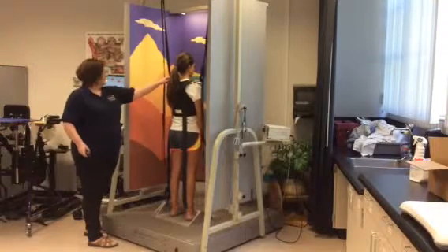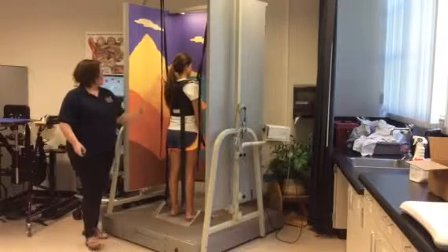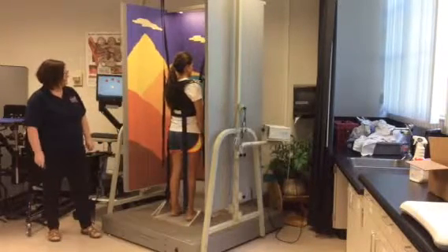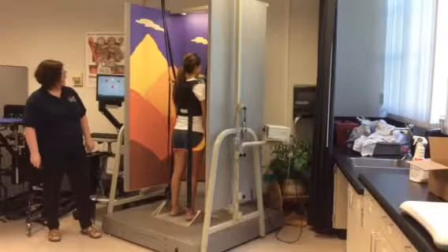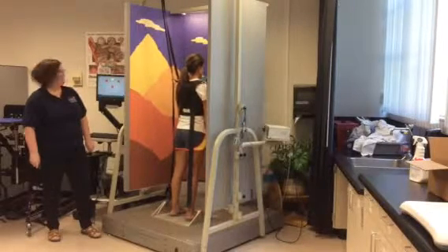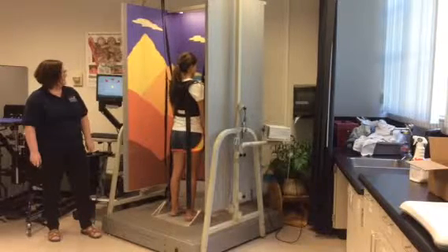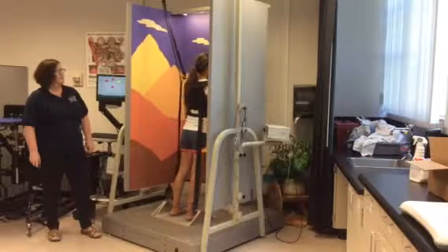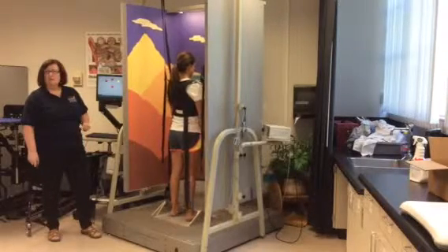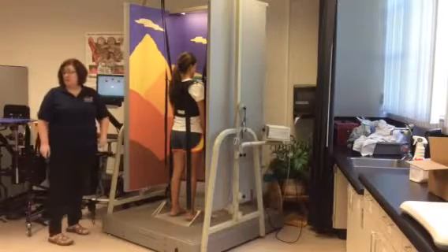Go. Now, notice what's happening. Okay, back to the center. Go forward, hold, get out there. Ooh, 80 might be a little bit, well, come on back. It's just outside of her reach. Over to the right. So can you see how much that's moving? It's about 60% of her movement.